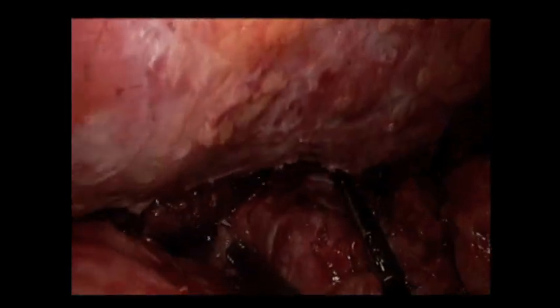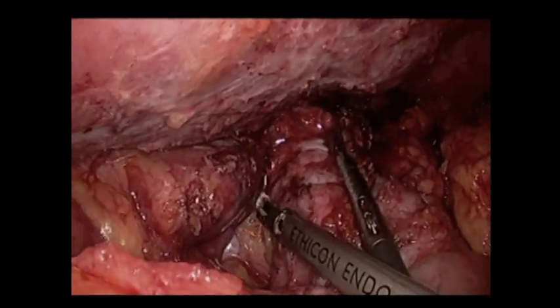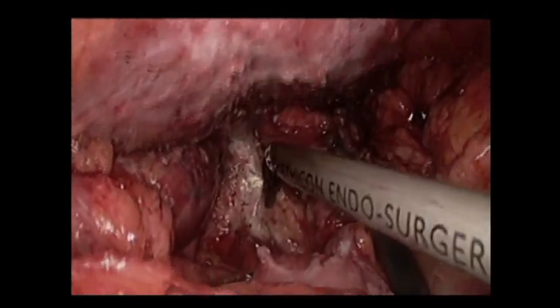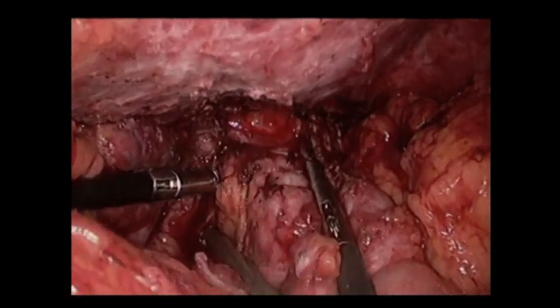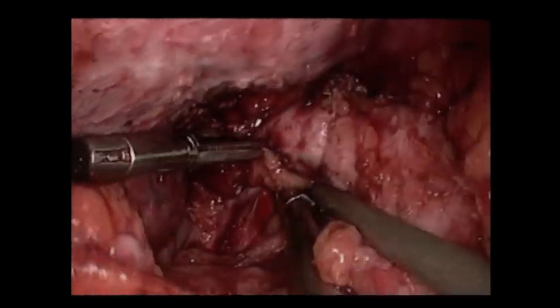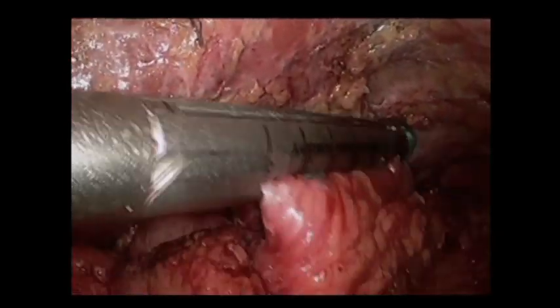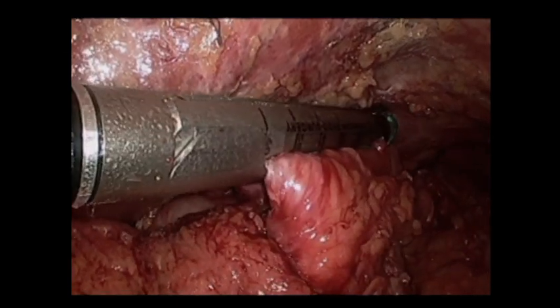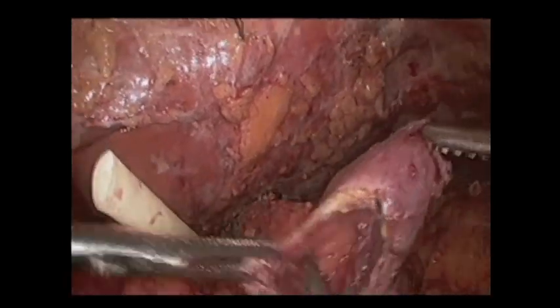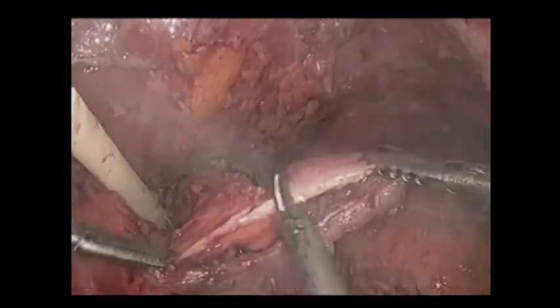We then proceeded with mobilizing the medial aspects on the right side and identifying the right crus of the diaphragm. We always like to dissect out the hiatus to make sure there is no hiatal hernia present. We placed an esophageal retractor under the gastroesophageal junction. We then stapled off the Roux limb proximally near the gastrojejunostomy, then divided the ischemic portion once it had been stapled off, so the proximal portion of the Roux limb is taken down at the gastrojejunostomy.